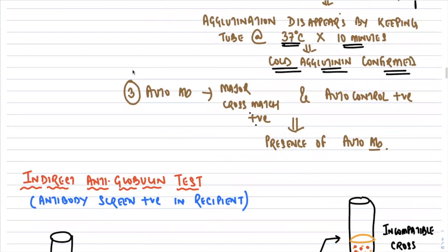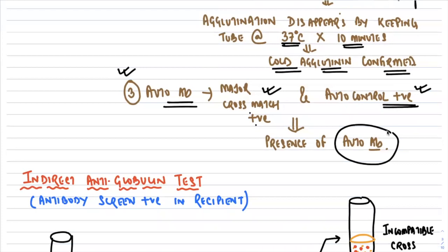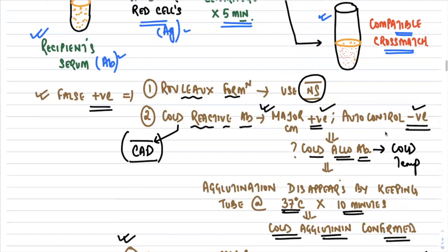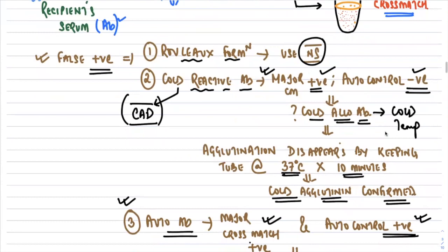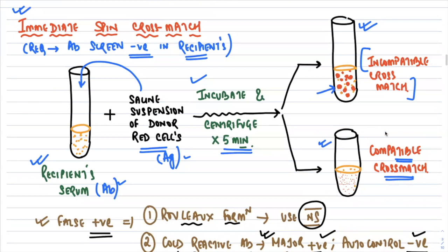The third cause of false positive cross-match is the presence of auto-antibodies. In this case both the major cross-match and the auto-control come out positive. If both are positive, it indicates auto-antibodies. Always remember these three conditions: rouleaux formation, cold reactive antibodies, and auto-antibodies.